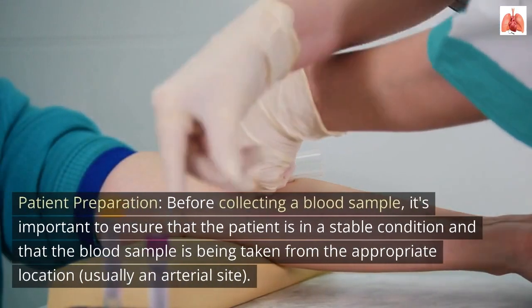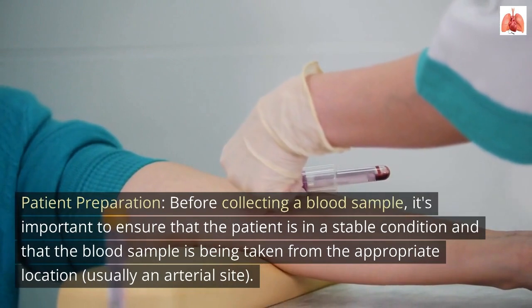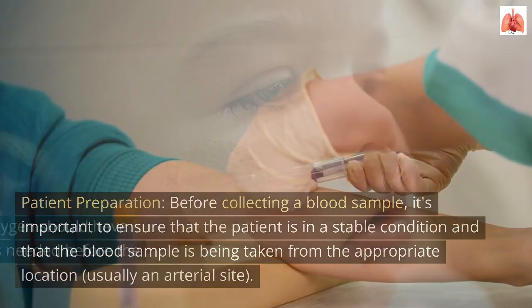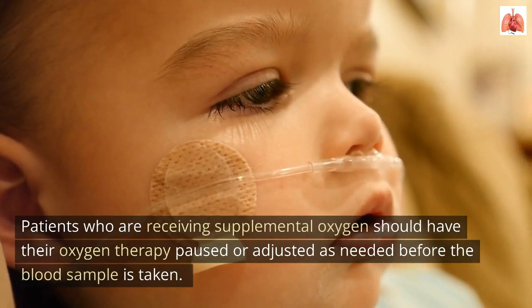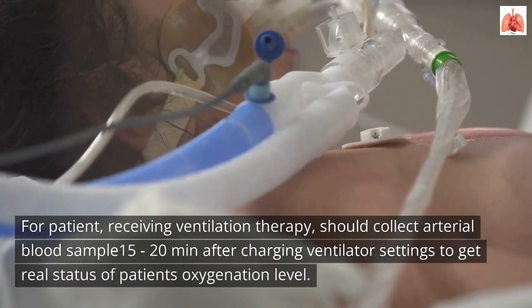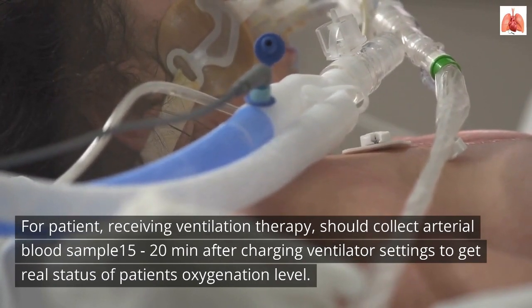Patient preparation. Before collecting a blood sample, it's important to ensure that the patient is in a stable condition and that the blood sample is being taken from the appropriate location, usually an arterial site. Patients who are receiving supplemental oxygen should have their oxygen therapy paused or adjusted as needed before the blood sample is taken. For patients receiving ventilation therapy, the arterial blood sample should be collected 15 to 20 minutes after changing ventilator settings to get the real status of the patient's oxygenation level.